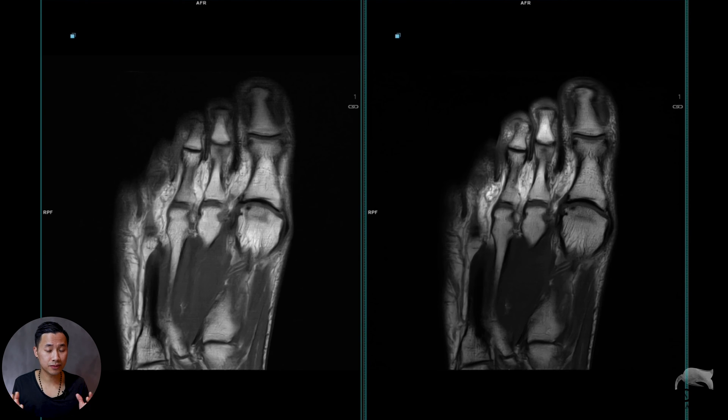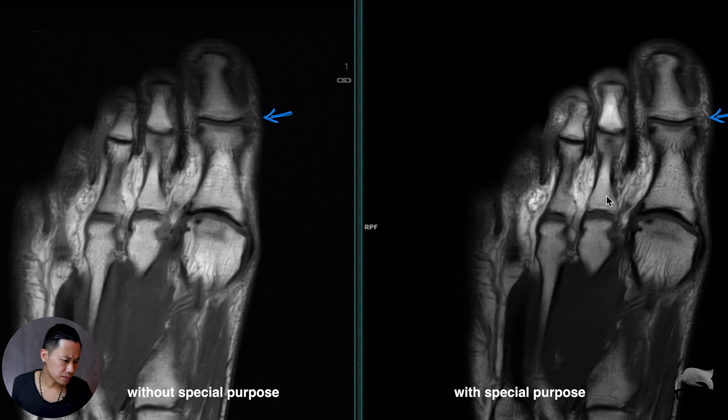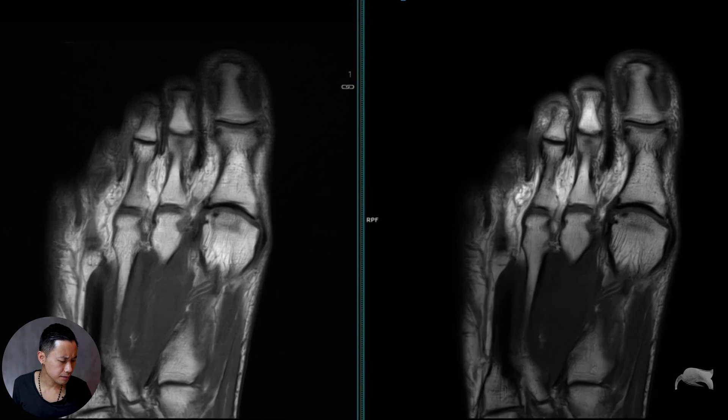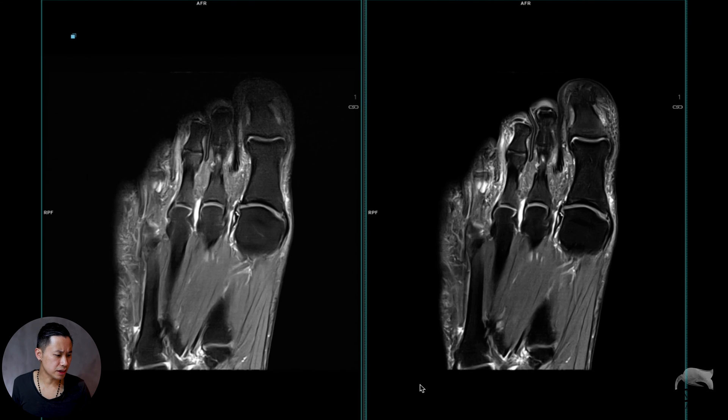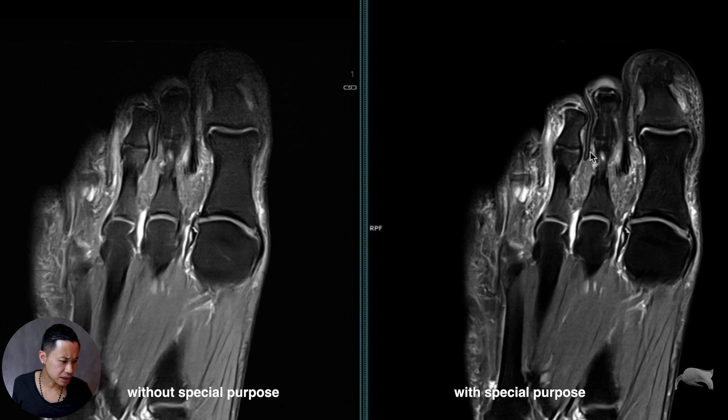Like I mentioned before, this is without the special purpose coil on, and this one is with the special purpose coil on. You can clearly see there is more signal in the front. It's a little bit difficult to tell on T1, but let's go to the PD and you will see the different impact. On the PD, same sequence — the only difference is the coil is on or off. Here the special purpose coil is off, and this is on. You can see the homogeneity here; the fat suppression is not that bad. There's a little bit of edema here and you can clearly see the signal difference. So if the patient has a very long foot, this can be one way to get good images. It's very easy and fast to just put on the coil.